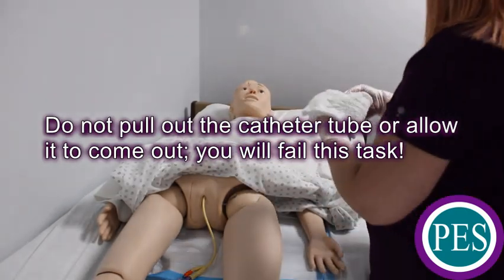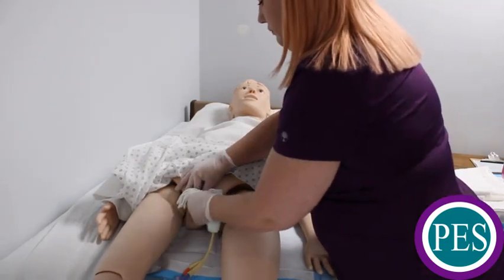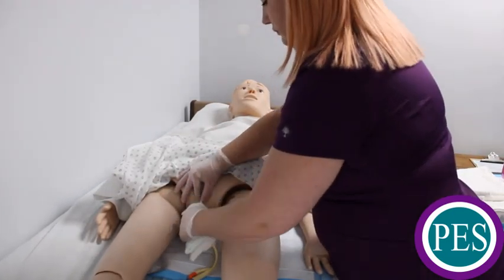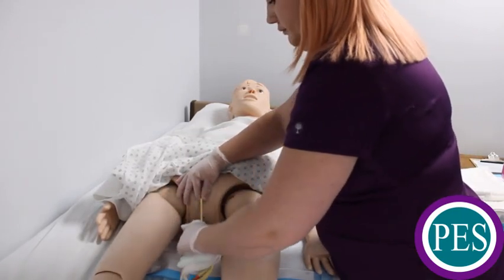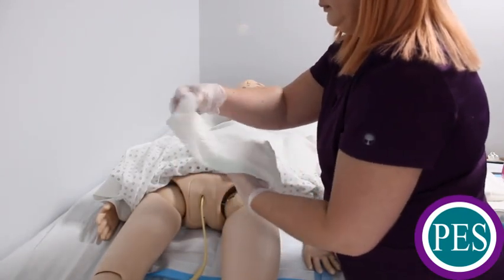Hold the catheter where it exits the urethra with one hand. While holding the catheter, clean at least 4 inches down the drainage tube. Clean with strokes only away from the urethra and use a clean portion of the washcloth for each stroke. In this demonstration, we are using the four-corner method when using the washcloth.